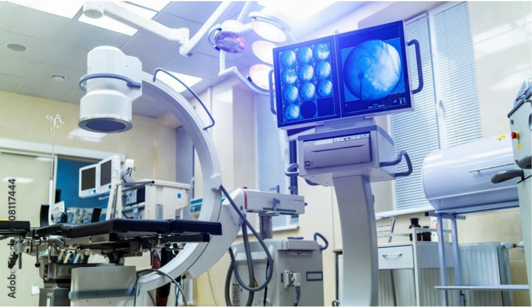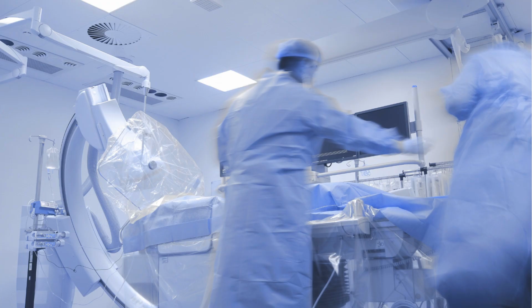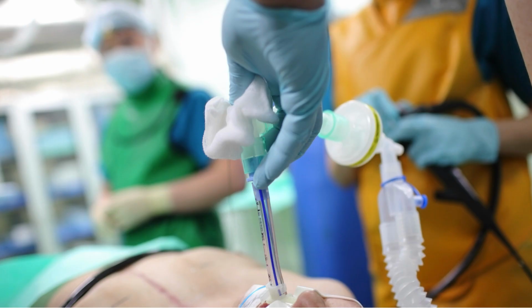Cath labs are an important part of treating heart conditions. A catheterization laboratory, or cath lab, is a procedural hospital room where minimally invasive tests and procedures are performed to diagnose and treat cardiovascular disease. The procedures performed in a cath lab involve tiny, flexible tubes called catheters, which is where the name is derived from. These catheters can be used as an alternative to surgery to access the heart and blood vessels.